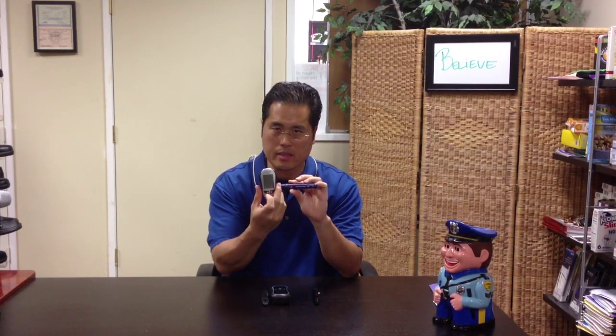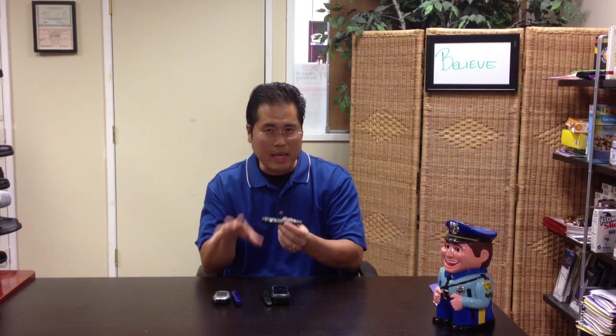Pretty revolutionary. The AccuCheck Multiclick always came with the Aviva. What they're doing now is they launched a new and improved version called the AccuCheck FastClick. It's based on the same drum technology, but they've made it a lot easier to use.